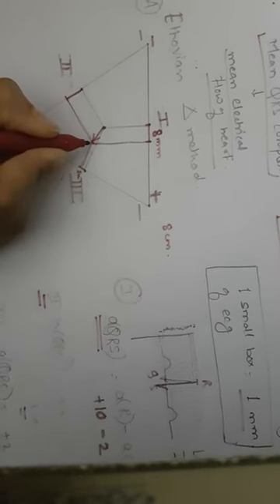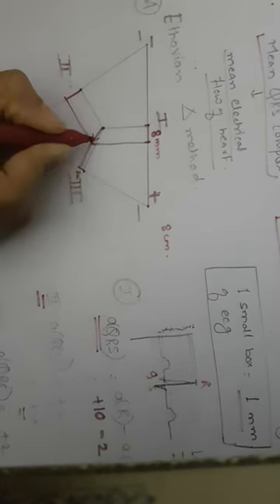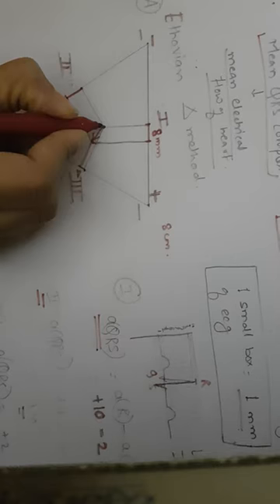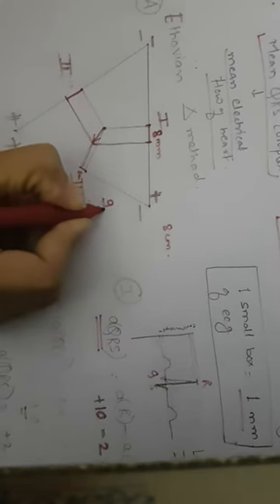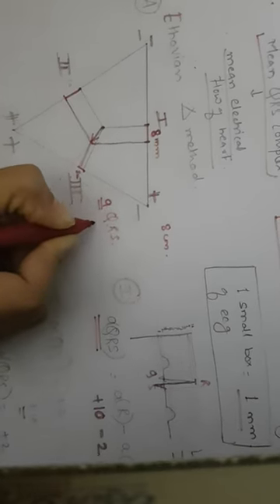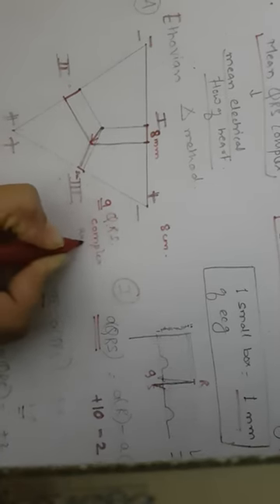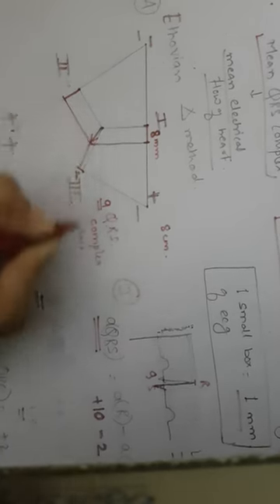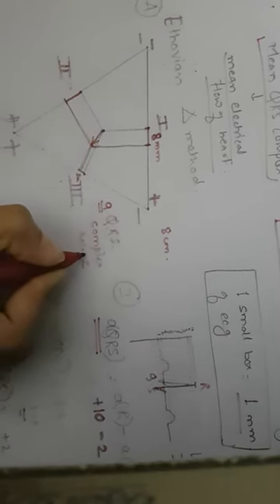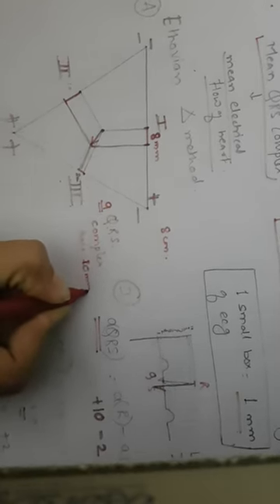So this is the mean QRS complex or the vector of the heart. You can find out by accurately measuring this length. You will get the amplitude of the QRS complex axis. If you find out by amplitude, it is around 10 mm.